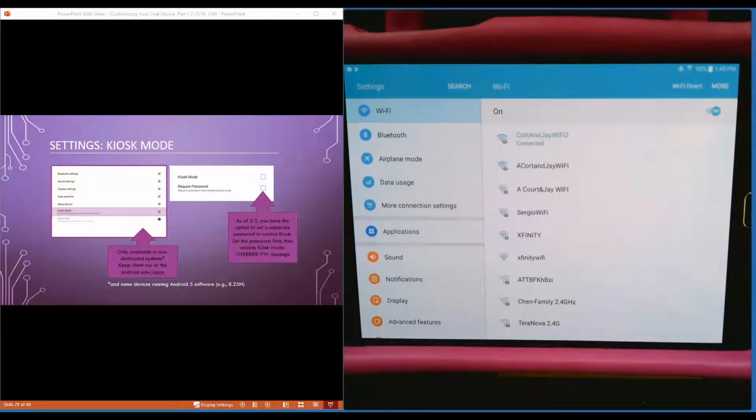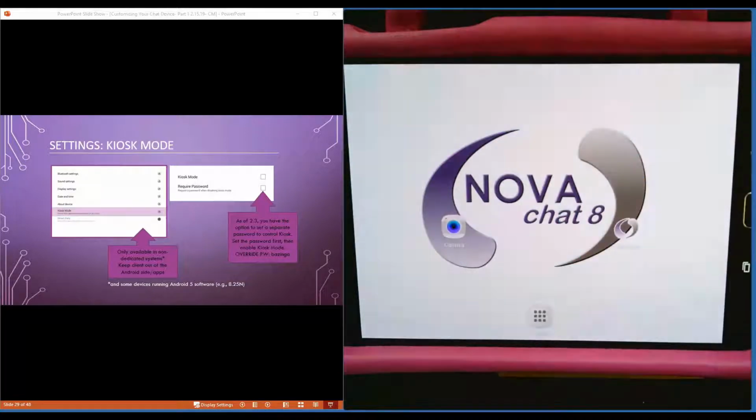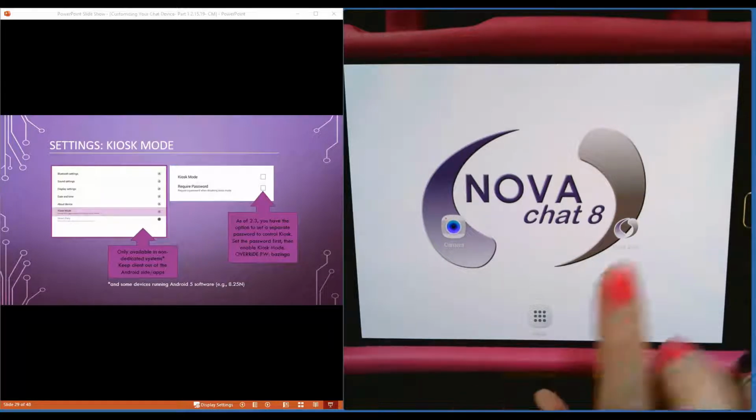So that's, if you connect it to your Wi-Fi, every time your device comes back home, similar to like our cell phones, the device will reconnect to Wi-Fi, and then it will automatically search for any updates and download and install those updates. I think it searches like every night at midnight or something like that. So I tell parents, when you first get your device, you go home, you take it out of kiosk mode, you hook it up to your Wi-Fi.